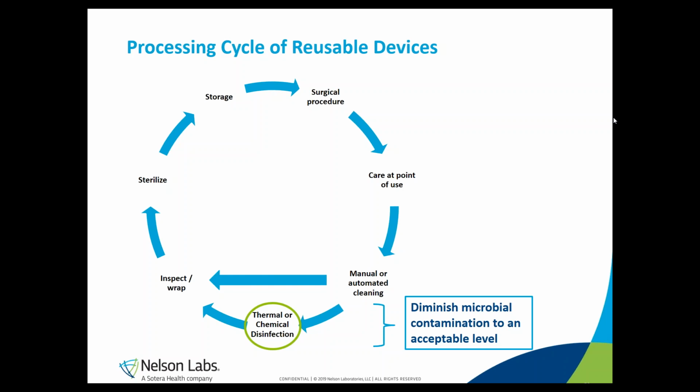So a disinfection validation demonstrates the efficacy of a process designed to reduce microbial contamination present on the exposed surfaces of a reusable medical device through either chemical or thermal methods. So to summarize, cleaning is all about removing contamination, while disinfection is all about killing germs to an acceptable level.